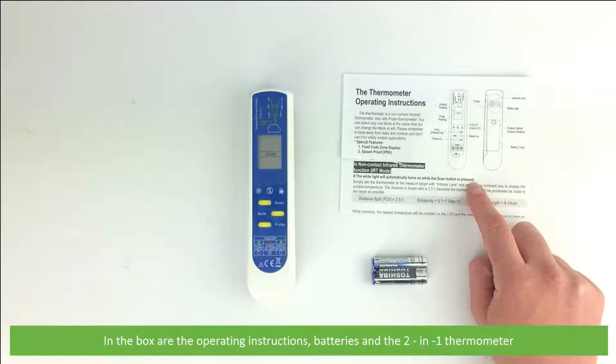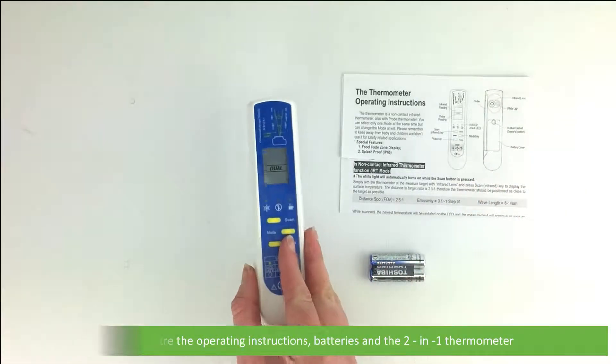In the box are the operating instructions, batteries, and the two-in-one thermometer.